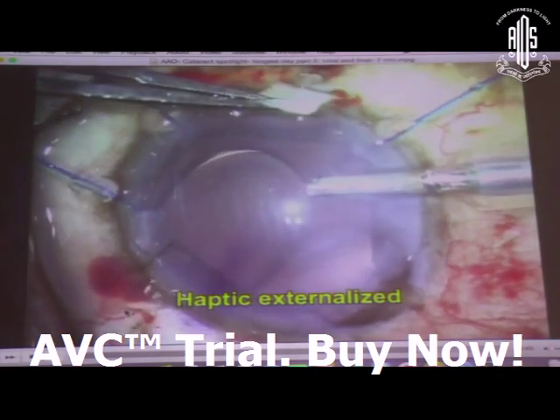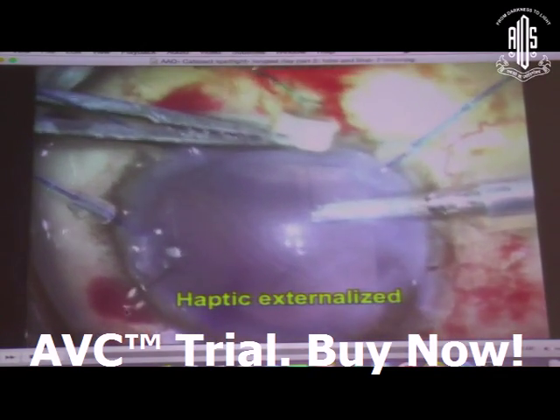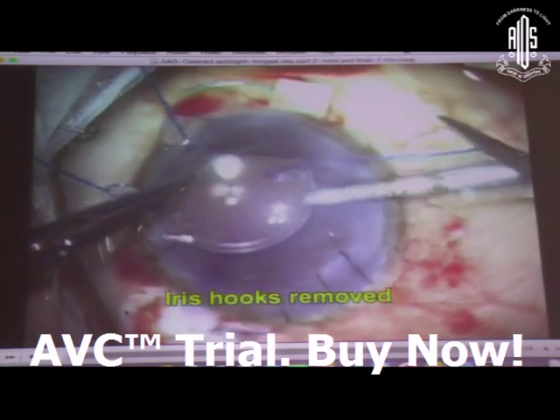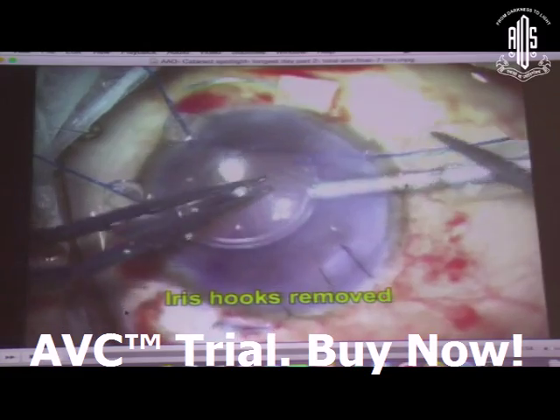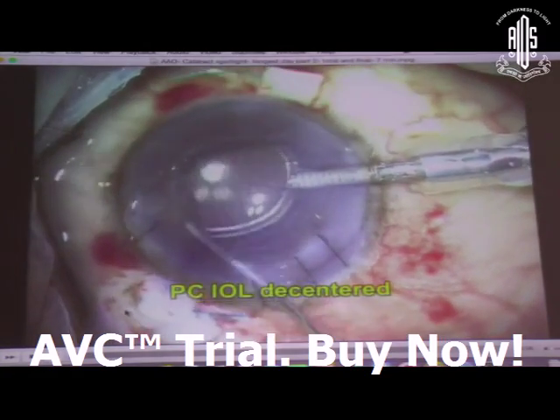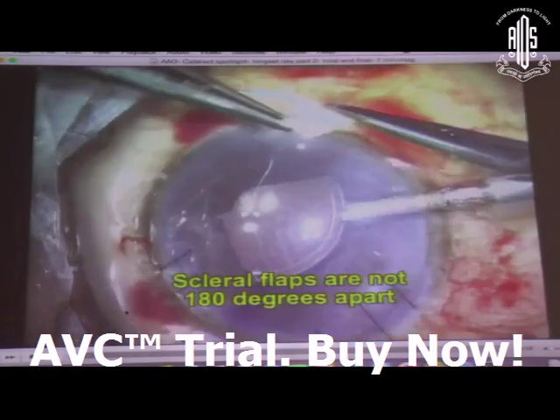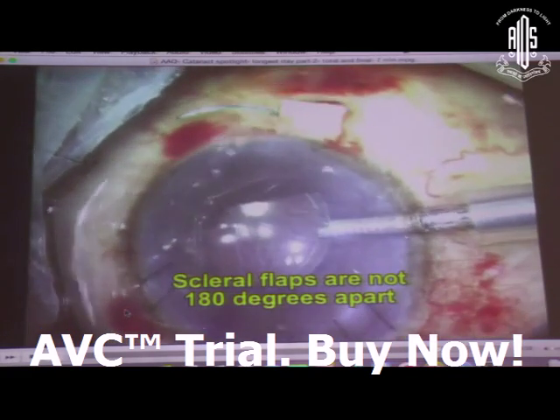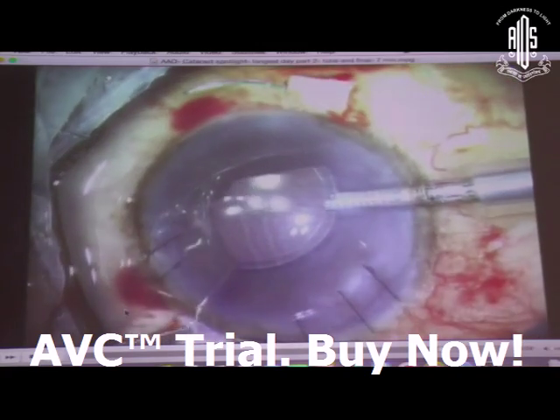But now look what's happening. My lens is decentered. So I didn't understand why it's decentered. And so I take out my iris hooks thinking the lens will become centered because of that. Obviously it will not. Then I began to realize I did not have a mark on the other end. So the flaps are not 180 degrees apart.